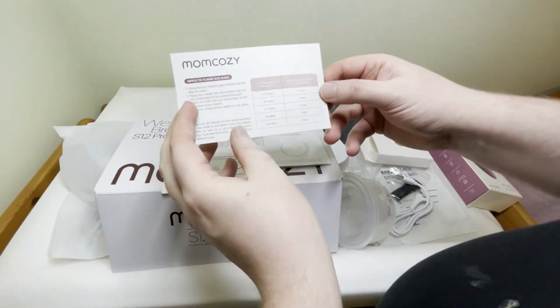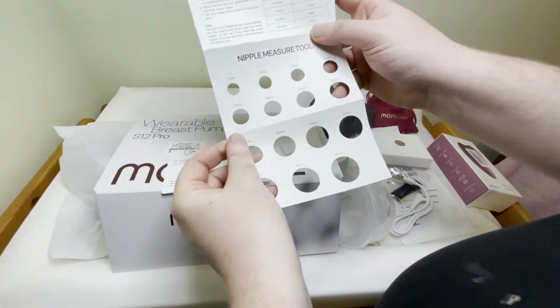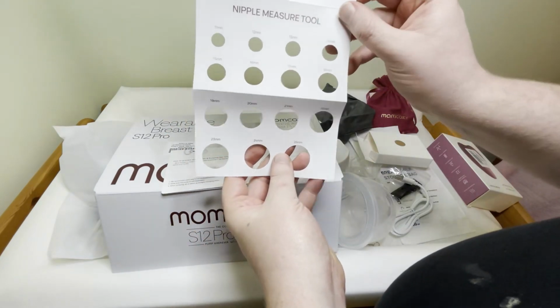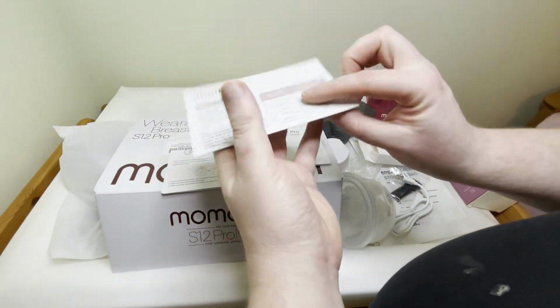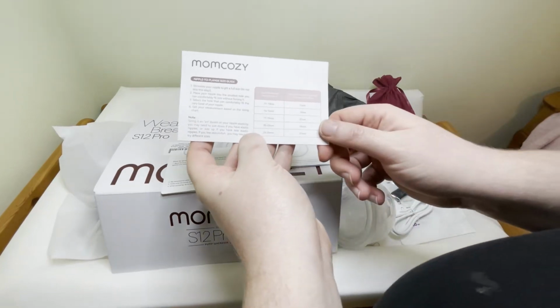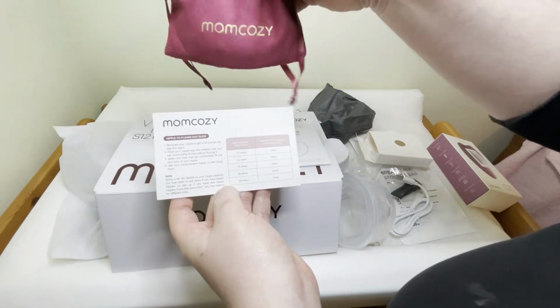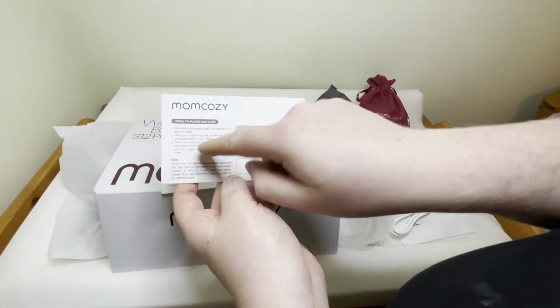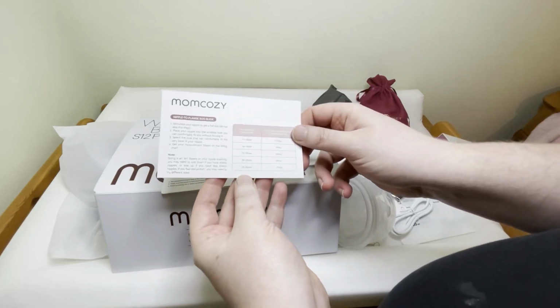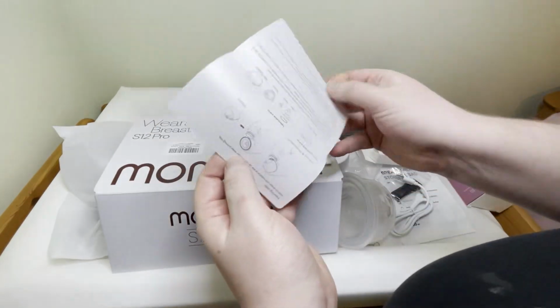So, nipple measurements, let's have a look. I'm guessing that's just the case of popping against you, helping you find the right guide to get this. It does say it is an art, so you might have to give it a couple of goes. Do not skip the stimulate. That's this. There you go. Place it into the smallest hole. Select a hole you can comfortably fit. Get the measurements based on the sizing. So it's telling you about the different sizes.